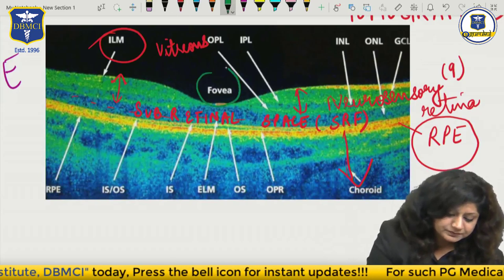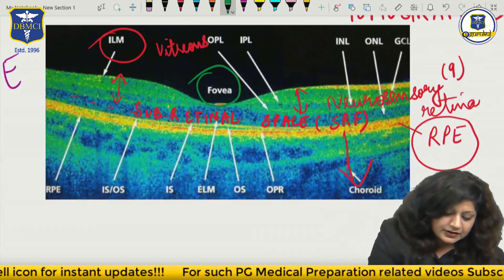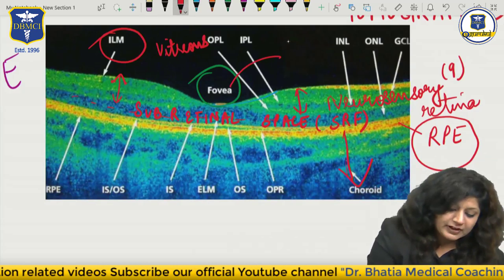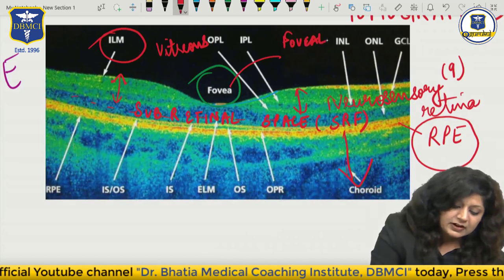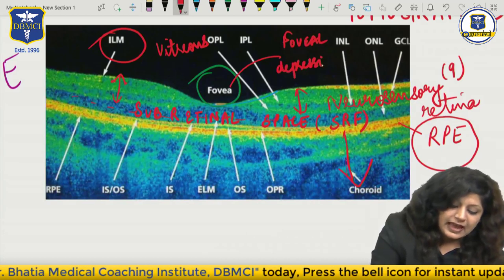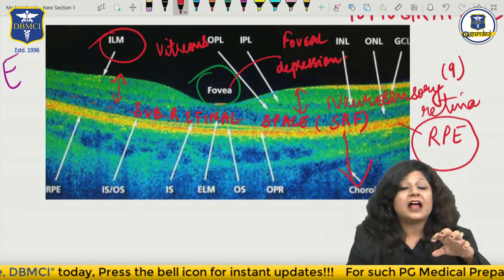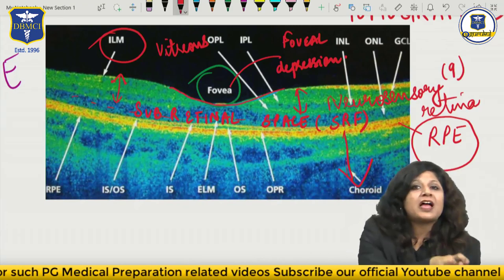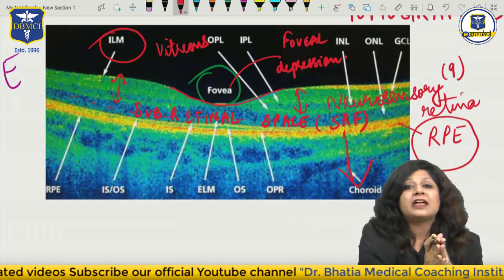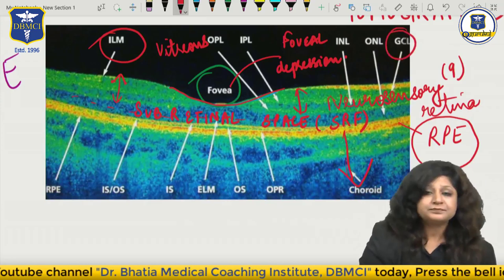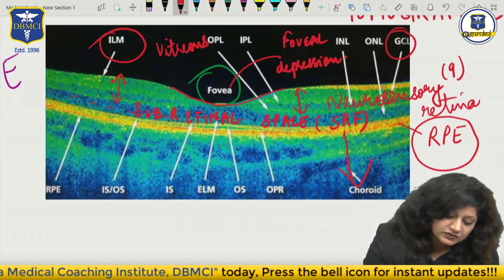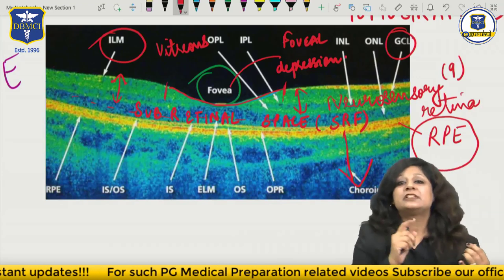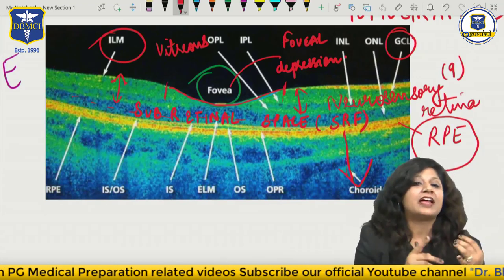Another important thing is the fovea. Can you see a depression here? This is called the foveal depression. Why is there a depression? Because there are some layers which are absent at the fovea. What layer is particularly absent? The ganglionic cell layer - this yellowish one coming up on both sides. It is the ganglionic cell layer which is absent in the fovea. That is why we have foveal depression.